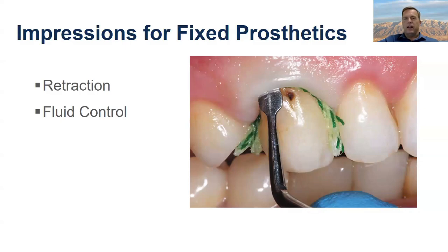I think that's a good idea. You want to make sure, especially when your staff's helping you out, that if you're doing something that needs a palate, like maybe you're doing a full arch case and you want to have a palate for indexing for the bite, or if you're doing removable, of course, you can't do that. But yeah, that can be a good trick, and especially good for gaggers. I really like that. Thanks for sharing that.